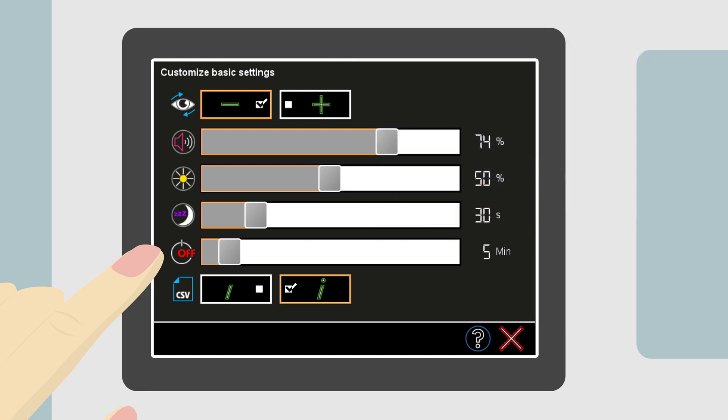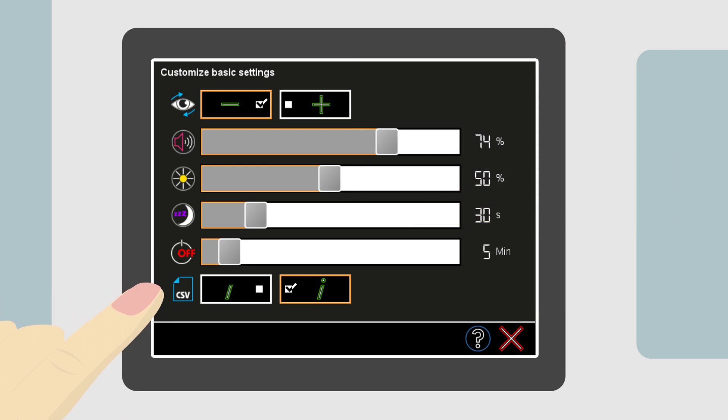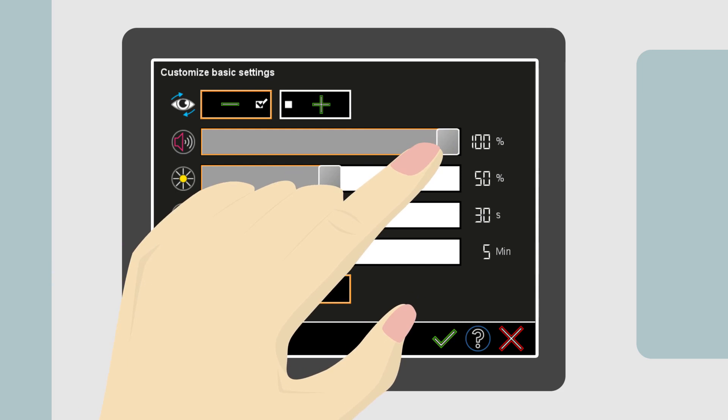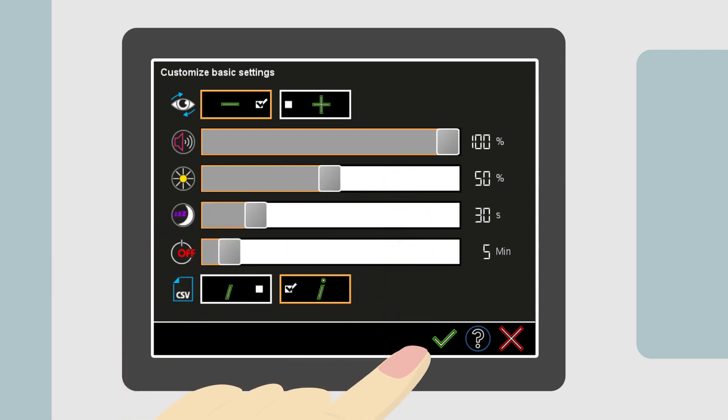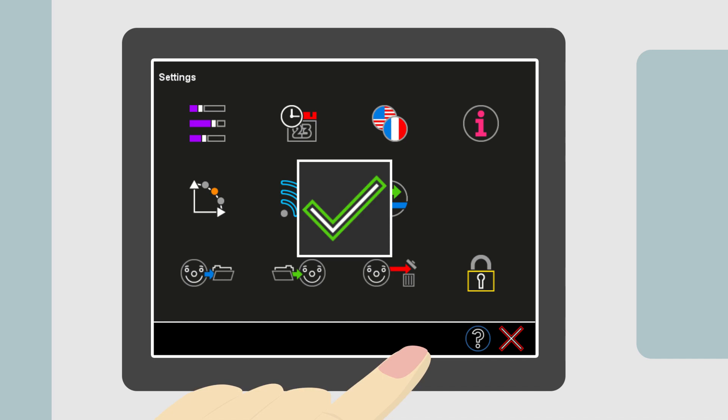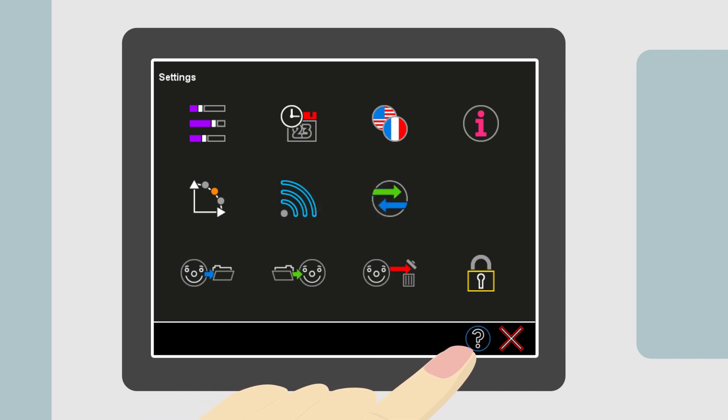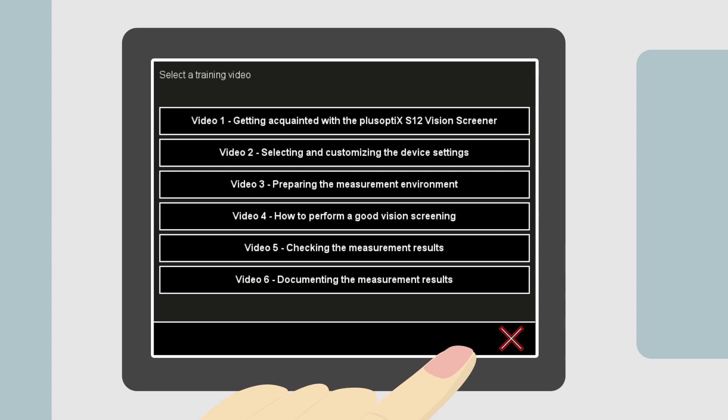Anna will need to remember to manually turn off the device when she is done. The last selection is the separator for data import and export. When Anna changes the volume, a green check mark appears in the navigation bar. Touching the green check mark saves any changes she has made. Touching the question mark button in the navigation bar will show a list of useful training videos — you can learn how to prepare a vision screening area and how to handle the device. Please note, watching the training videos does not replace reading the user manual.